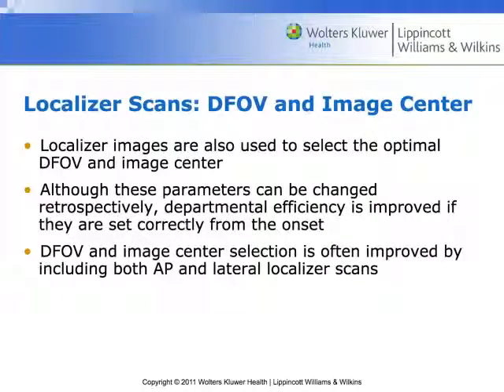So she mentions again, this is going to allow us to select an optimal display field of view. Do y'all remember what I talked about in terms of what is an optimal display field of view for most of what we do? What do we want to make sure to include within the scan? Region of interest. The region of interest, good. That's a good way to put it, or the volume of interest, a VOI, a volume of interest.